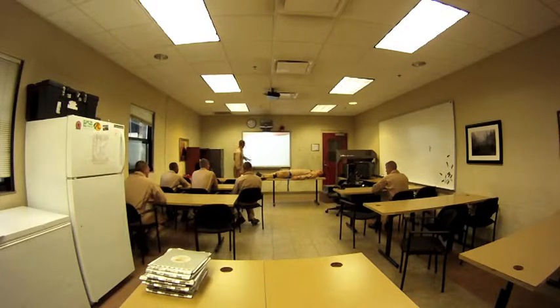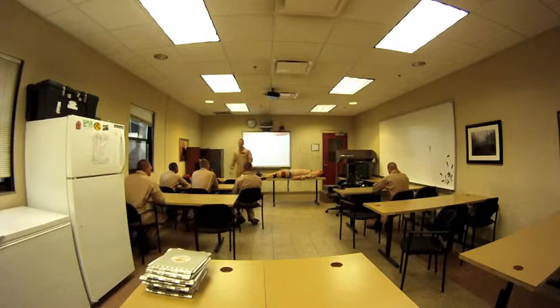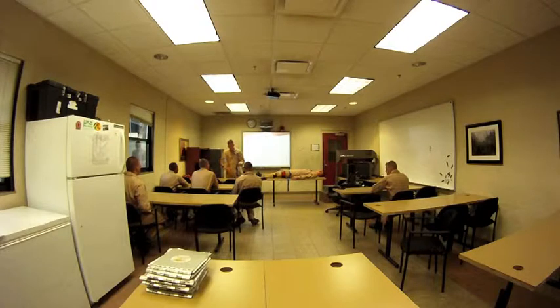All right, we just did that. Like I said, in one section, at least one section, and buckle that into the pelvic crest. All right, the next step is secure the strap, the red strap. Go ahead and secure that around his upper knee. Just like so. Anyone have any questions so far? If the break is in that exact spot, are you still able to secure it there? If the break is in it, go up higher. Just secure it higher than the break.